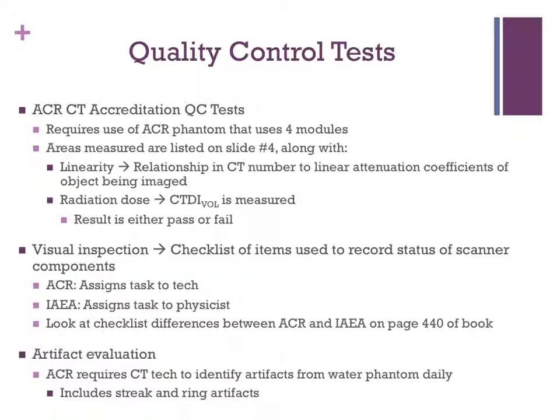Regarding artifact evaluation, the ACR also requires the CT tech to be able to identify and correct image artifacts from a water phantom on a daily basis. These artifacts include both streak and ring artifacts, and we also discussed this a little bit more in depth in chapter 9.